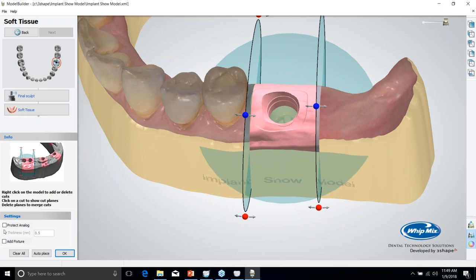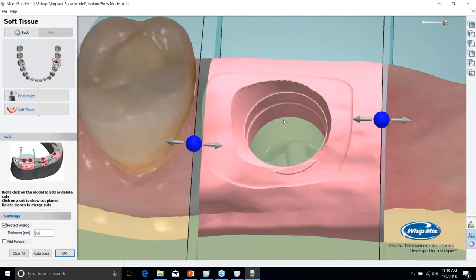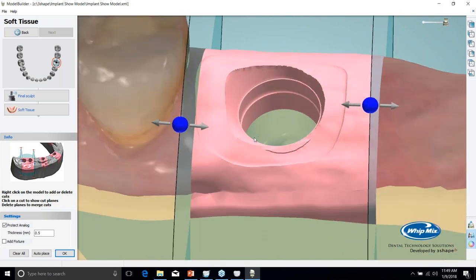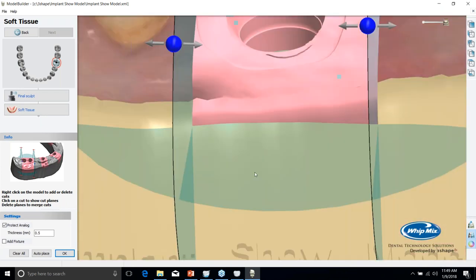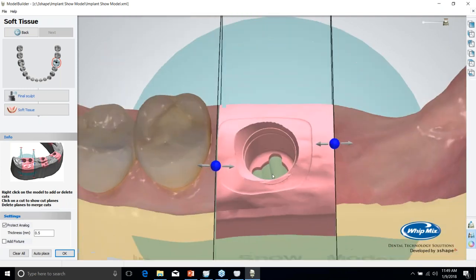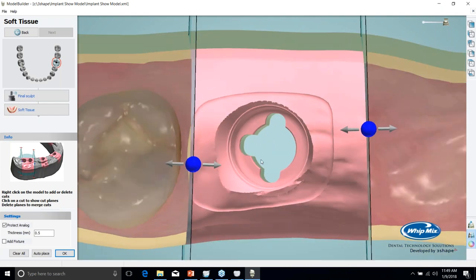There's two options here that you may want to use. The first one, protect analog. If I turn that on, the thickness is how thick it makes this protection wall. Essentially, if I don't have that on, it's going to cut this exactly where these lines are, including through this index portion. So if I had this bottom one way down here for a thick tissue moulage, that's actually going to be cutting through the index portion and all the wall that supports that analog.